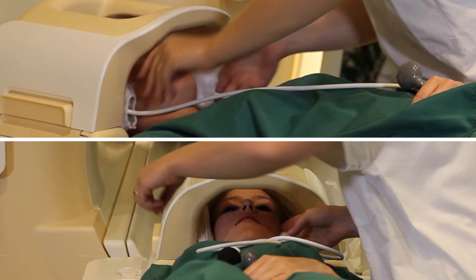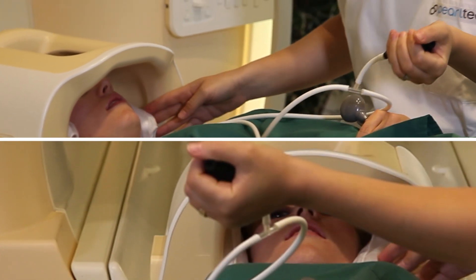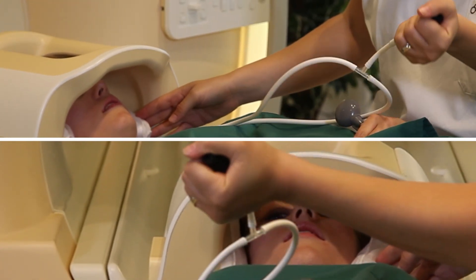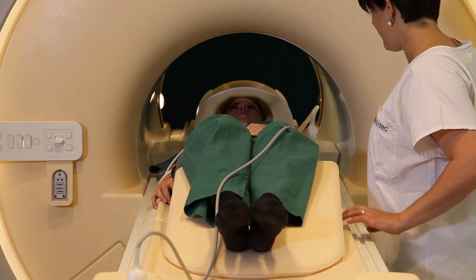Use the simple hand pump to expand the pad and stabilize the patient. The air pressure can be adjusted to your needs and the patient's comfort. Once inflated, place the pump away from the patient call button and the coil. Now you're ready to begin the examination.